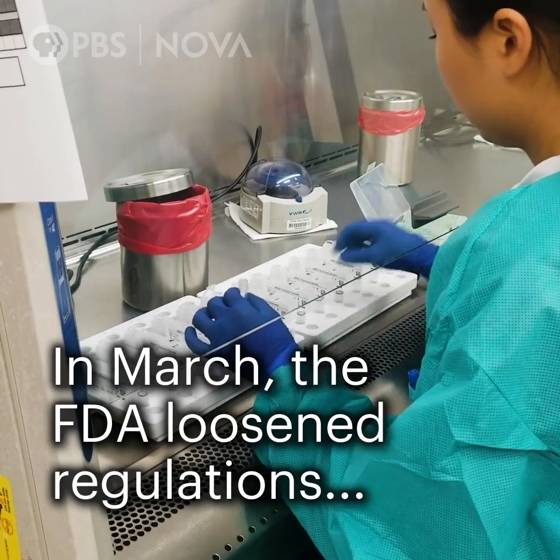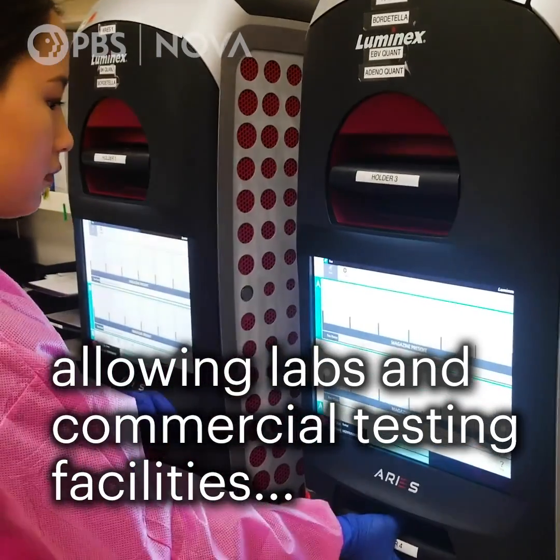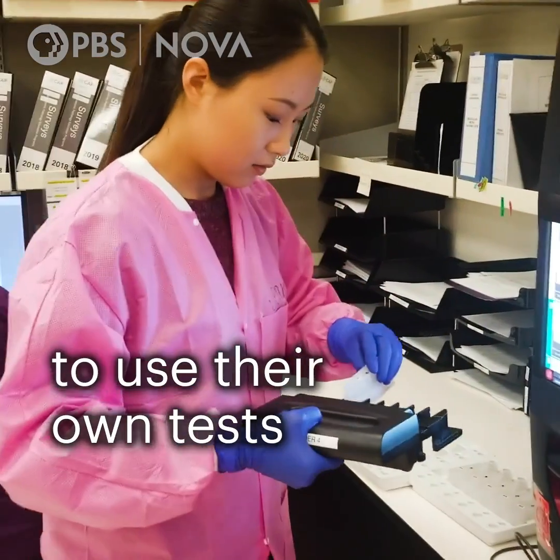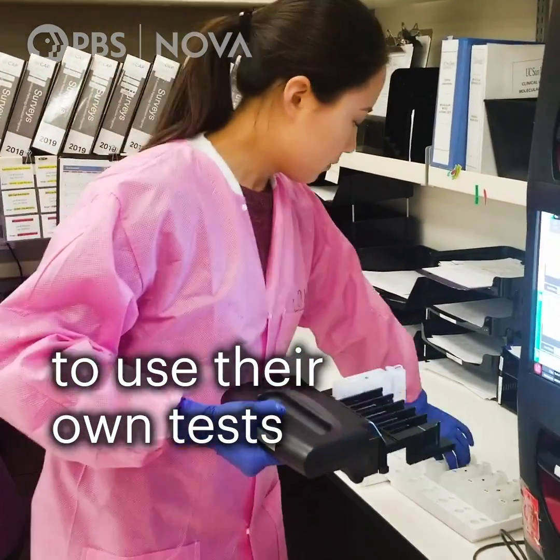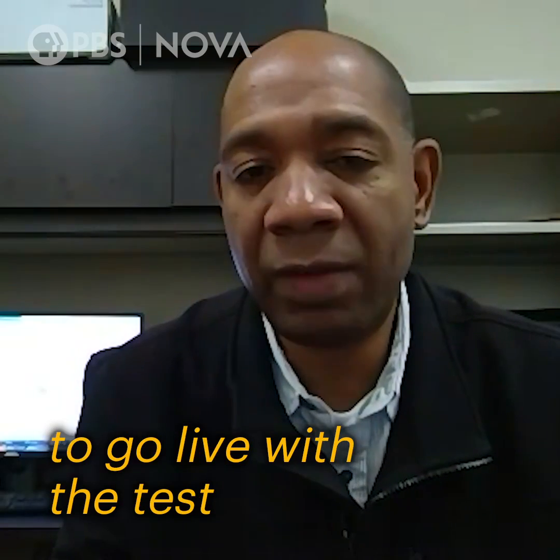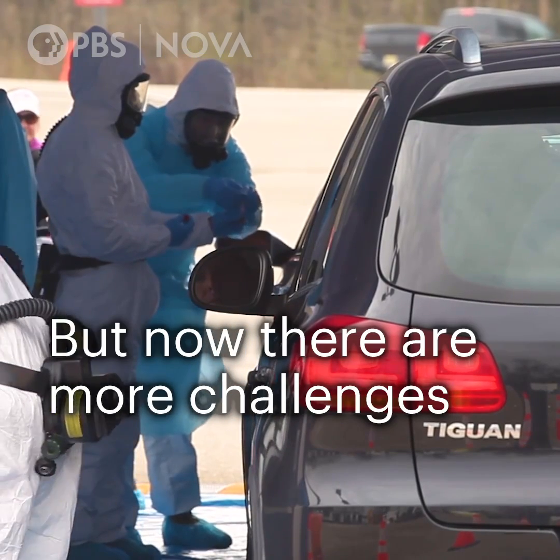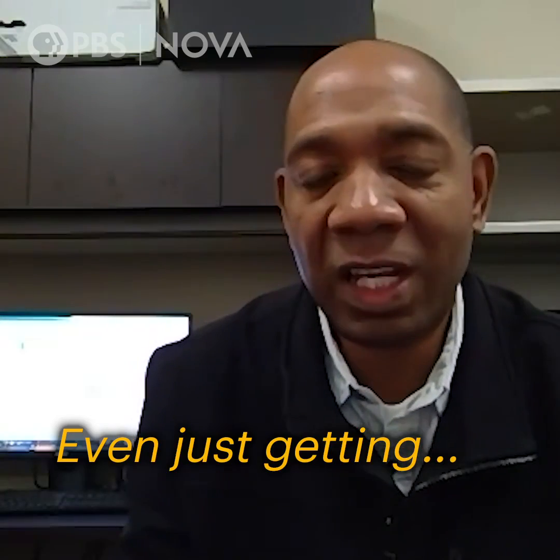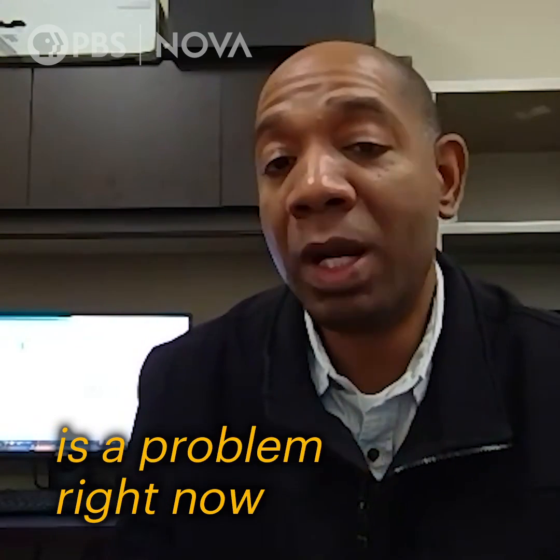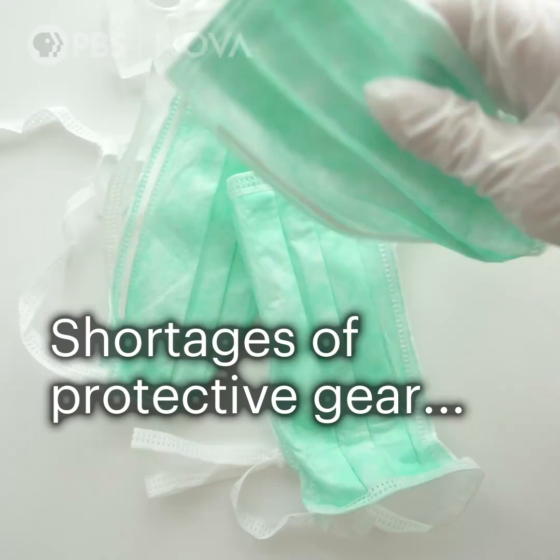In March, the FDA loosened regulations, allowing labs and commercial testing facilities to use their own tests. That's really sort of a significant step, and that's what allowed us to go live with the test. But now there are more challenges. Even just getting materials to extract the RNA from the virus is a problem right now. Every step of the way, we are experiencing bottlenecks.